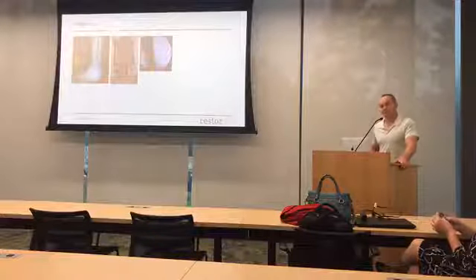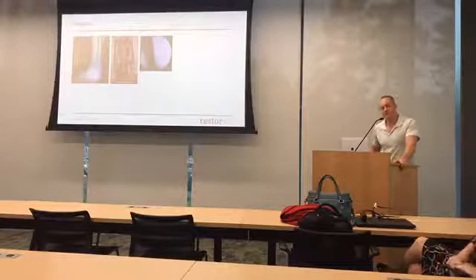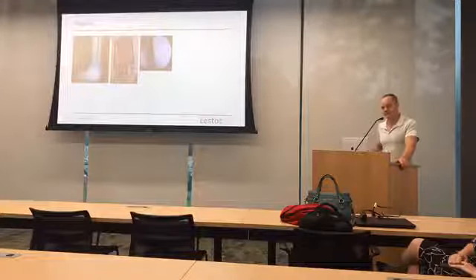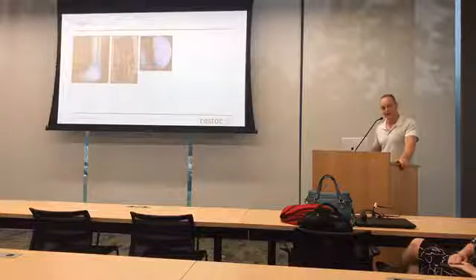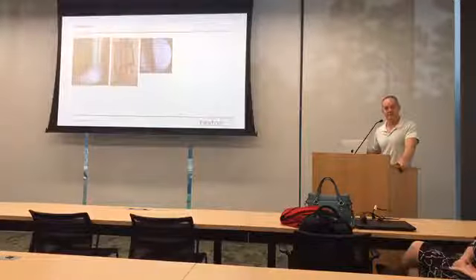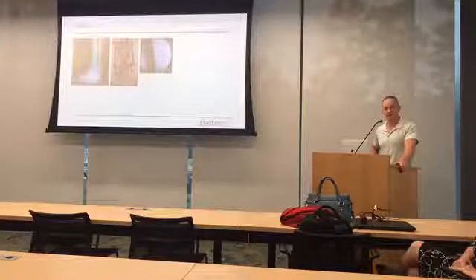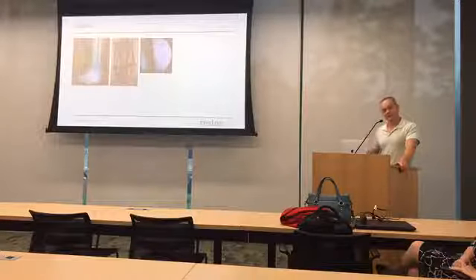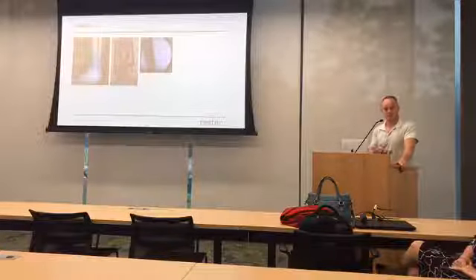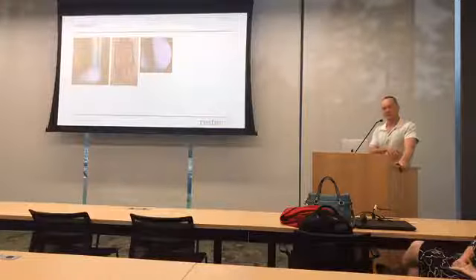Another case, I'll give you just an example and then kind of show what we're doing. We had a 17-year-old patient with a very large osteosarcoma in his pelvis. And so you're faced as a young patient like that with two choices. One is to have a very large part of that removed. In this case, you have to remove the entire side of the pelvis. But if you remove the entire side of that pelvis, the problem is that then you can't walk, essentially. There's no way to reconstruct that in a way that you can walk, because you can't attach your femur back to there.